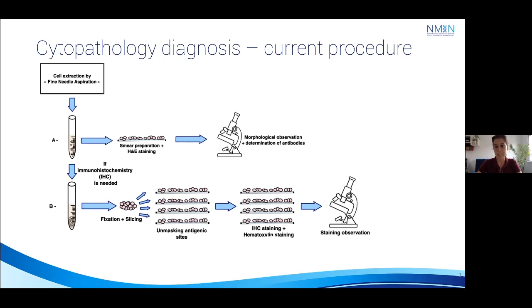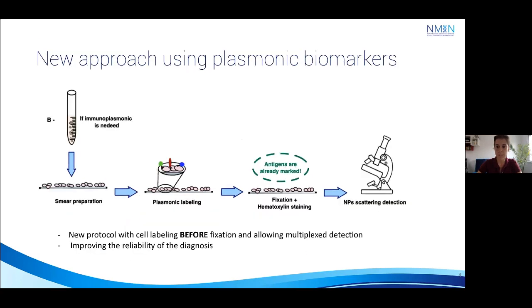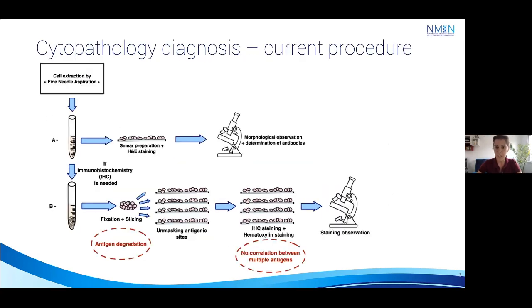The problem is that from one slide to the other, you cannot ensure that you are looking at the same cell. So you cannot really correlate between multiple antigens. And that explains why the diagnostic is quite difficult to make.